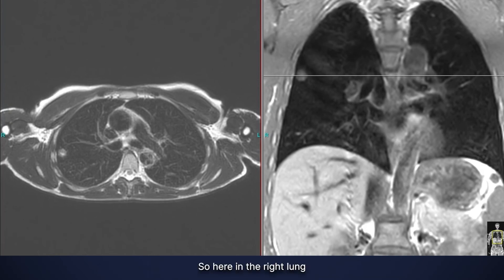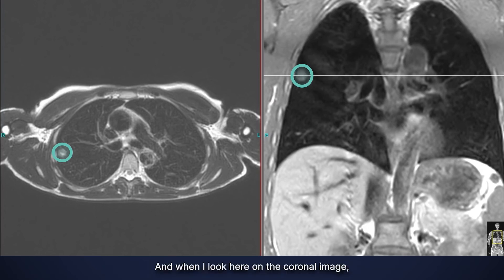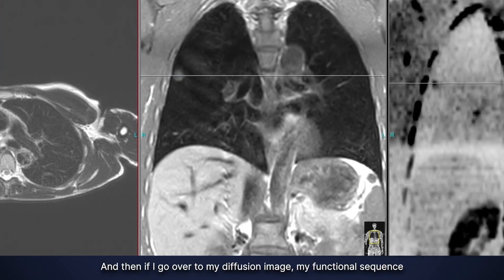Now that we've seen what normal lung looks like, let's see what abnormal lung looks like. Here in the right lung, we see a round mass in the mid to upper portion of the right lung. When I look at the coronal image, you'll see a corresponding mass right there.